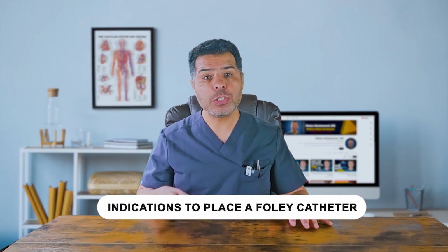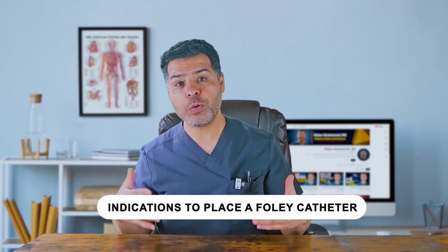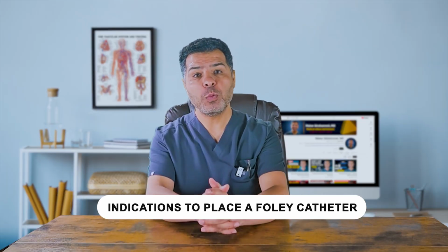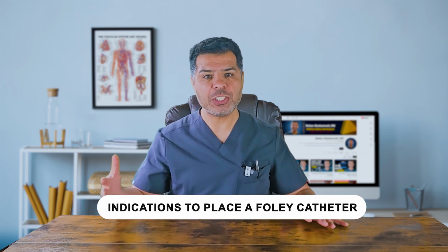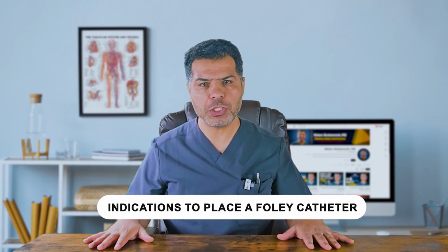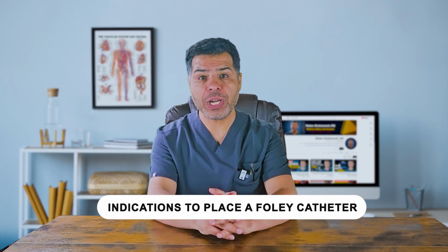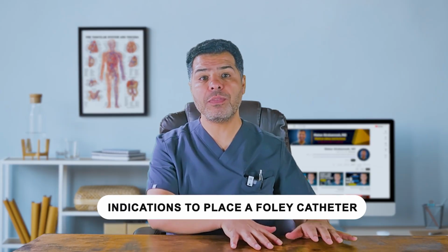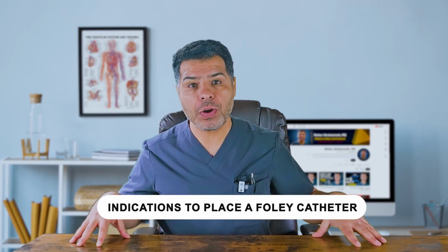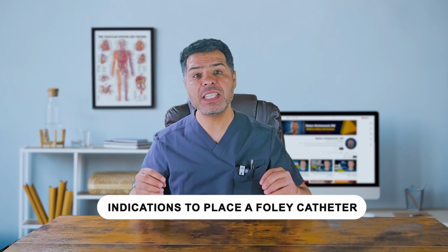The following are considered inappropriate indications to place a Foley catheter. Just because the patient is elderly or incontinent, that's a non-indication, or convenience for the caring team, or to get a urine sample when the patient can void. Use a midstream clean catch instead. And of course, social reason without clear medical necessity. These are inappropriate indications. Remember this, every day a Foley catheter stays in, the risk of catheter-associated urinary tract infection increases by about 3 to 7%. Catheter-associated UTI can kill the patient. So if it doesn't meet appropriate criteria, do not place it. And if it is already in, ask every single day, does the patient still need the Foley catheter or not?